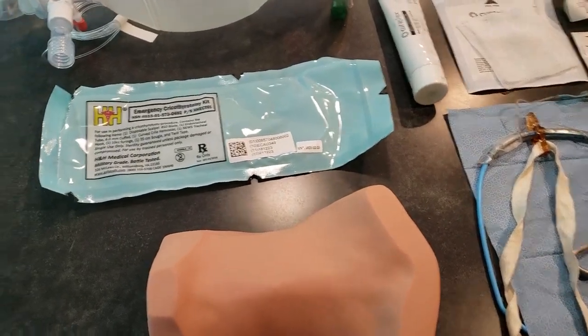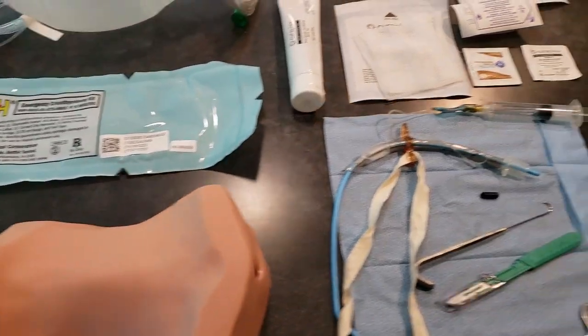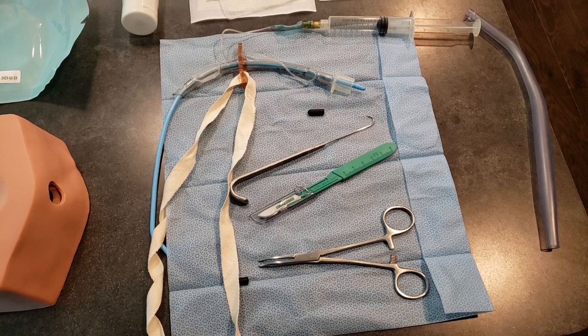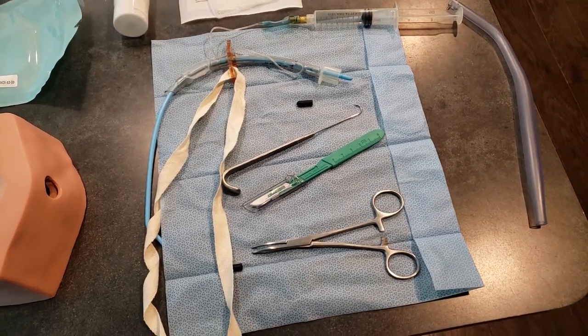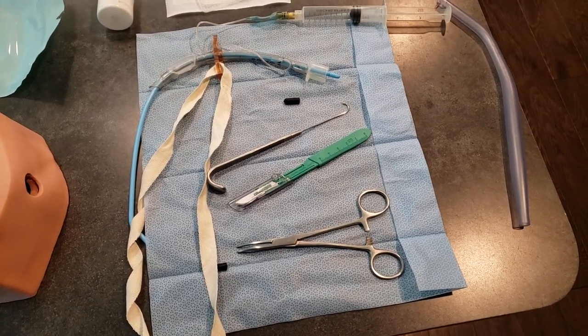The equipment that we have here is the H&H emergency cricothyroidomy kit. It has a three-year sterility shelf life and its contents include a number 10 scalpel and a shortened 6.0 tube that's engineered with a flange and a cotton securement strap, and a 10 to 12 cc syringe.